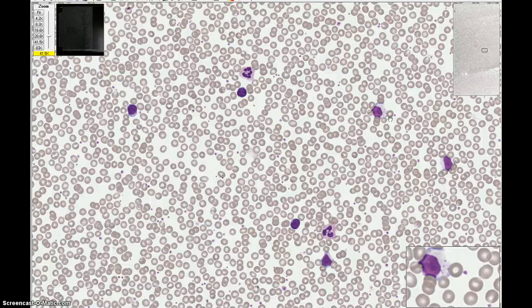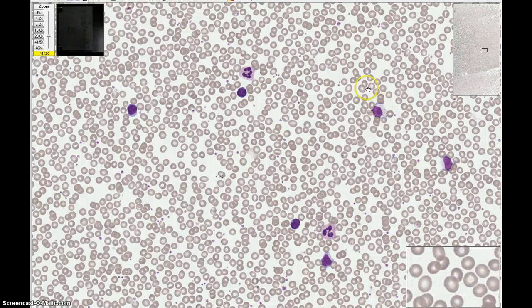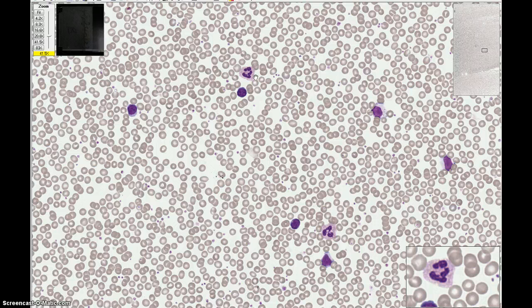Now that we've gone through the typical white blood cells seen in a peripheral blood smear, let's try to identify the rest of the white cells on this field. I'll give you a few seconds to try to identify this one on your own — remember to look at the nucleus, cytoplasm, and granules. This nucleus has three or four lobes. The cytoplasm is a light pink color, and there's an abundance of lavender colored granules. So this cell is a neutrophil.